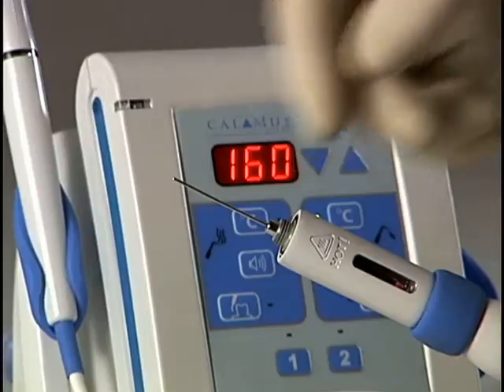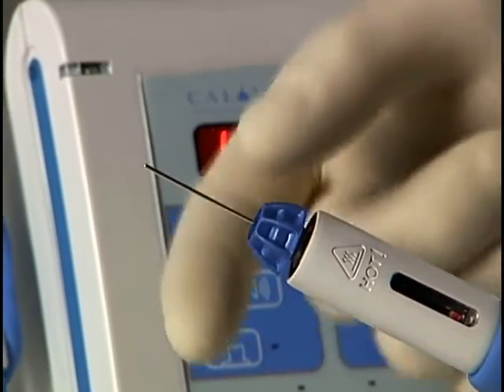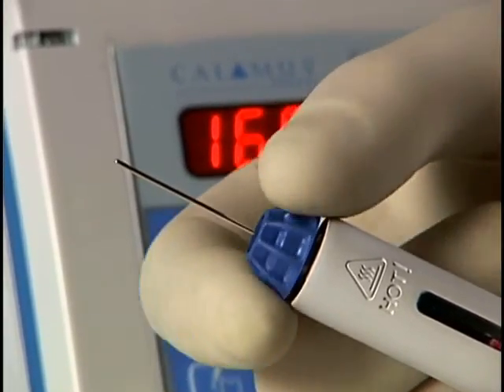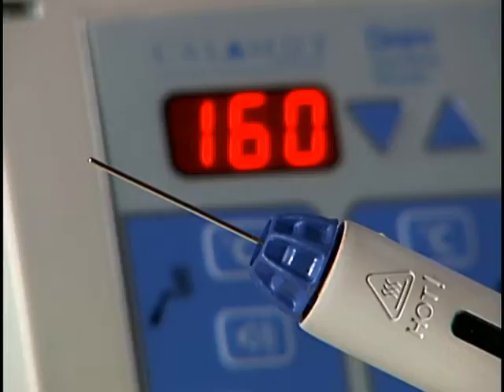When the Calamus Singles cartridge is in place, carefully place the cartridge nut over the needle. Gently finger tighten the cartridge nut onto the handpiece. Do not over-tighten this nut. The gap between the cartridge nut and the body of the handpiece is normal and is necessary for heat dissipation.